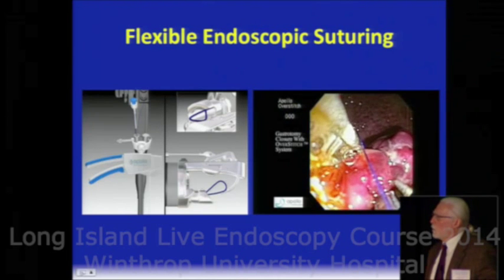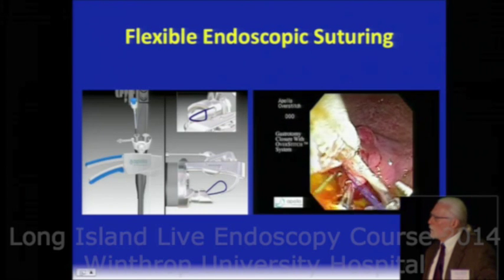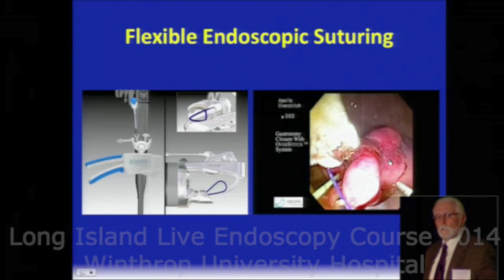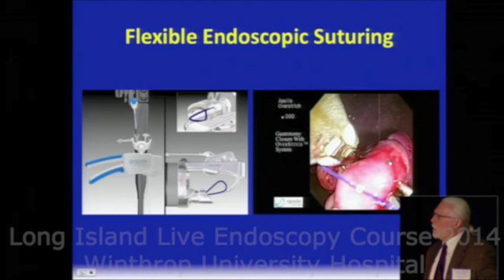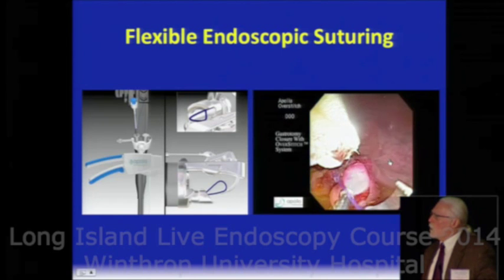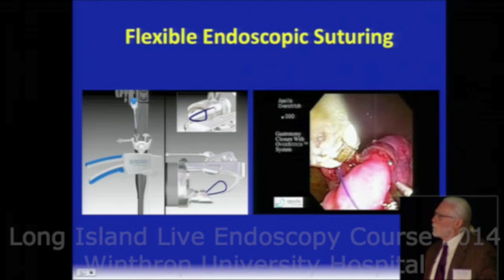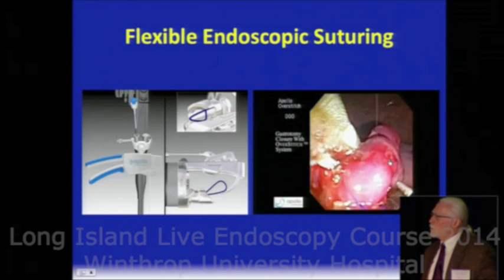The first suture will be a running stitch for about 6 to 8 stitches, and then there'll be a little dog ear at the bottom that you'll see in a few seconds, and that will be closed separately with a second suture line. Now the difference between what you're seeing here and what would be done by hand: a hand closure could be interrupted, 2 stitches and a tie, or a running stitch, and you'll get a linear closure pattern here. Because this is a cinched closure, which you will see, the suture is dropped upstream and the tail end of the suture is downstream.